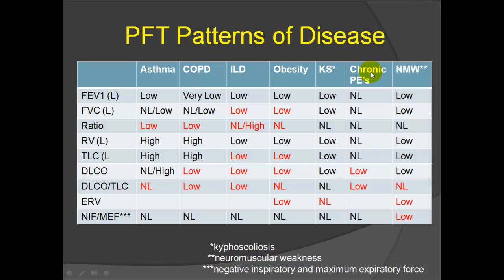Chronic pulmonary emboli are a special case as an example of what we call an isolated diffusion deficit. Simply put, lung functions from PEs are normal, but from chronic pulmonary emboli with overall accumulation of a clot burden in the capillary bed, the diffusion capacity gets clipped off, there's loss of effective circulating area of diffusion, and the diffusion capacity stands out as the main deficit on pulmonary function tests. Other diseases that have this pattern are chronic vascular diseases, such as pulmonary vasculitis.